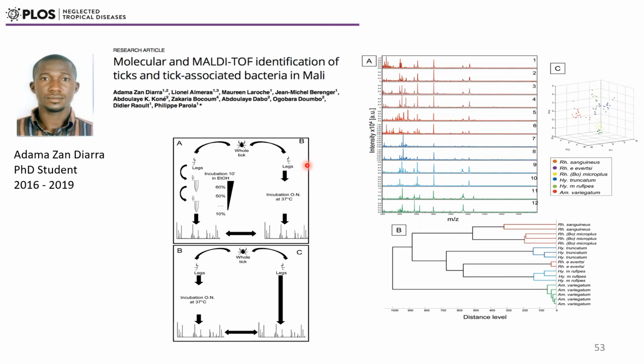So we kept working on ticks. This is the work of Adama. He brought ticks from Mali, but this time the ticks were in alcohol. So we had to find a suitable protocol. And he tried two things.